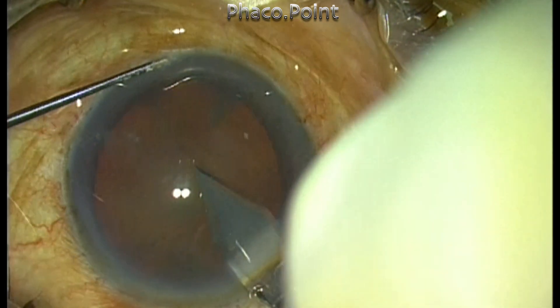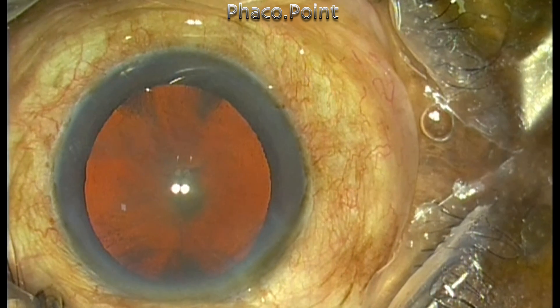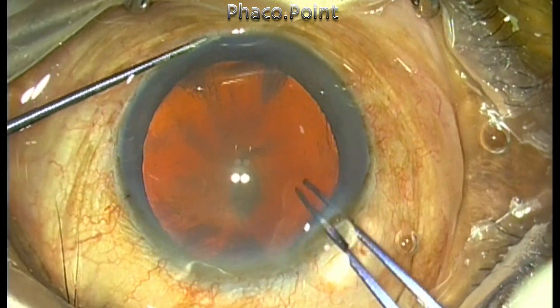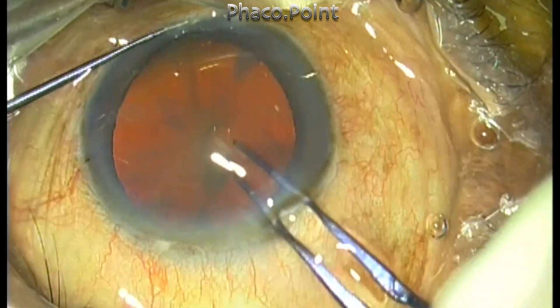I create the incision and a small opening in the anterior capsule in order to create the capsular rexes. A small amount of 1% xylocaine has been instilled into the anterior chamber. I don't stain the capsule because of the good red glow I get, in spite of this being a very hard cataract.